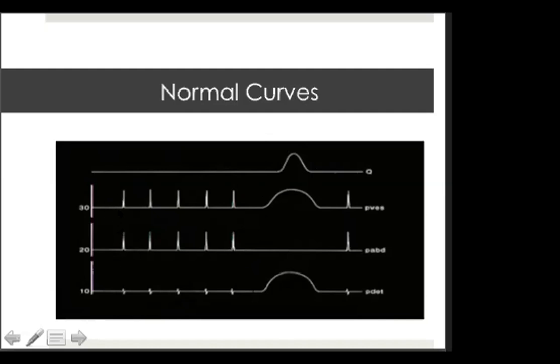For example, at any time during the test, we can instruct the patient to cough. So these are the pressures that rise during stress. There should be no incontinence seen here. As for the detrusor pressure, usually when the detrusor pressure rises, the vesical pressure should also rise. Even during voiding, sir, the abdominal pressure is not affected.